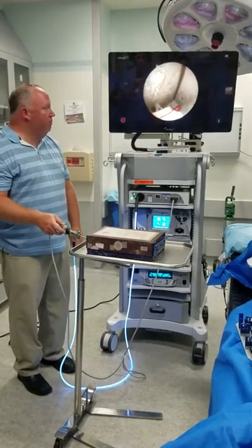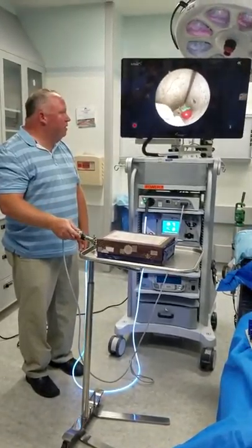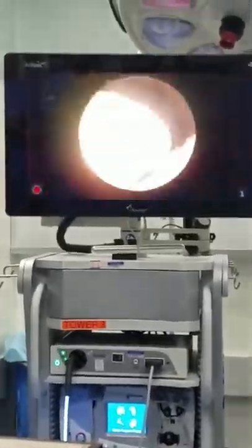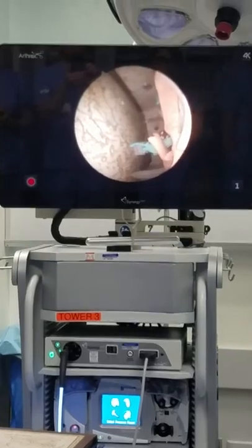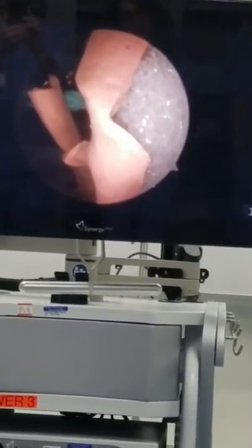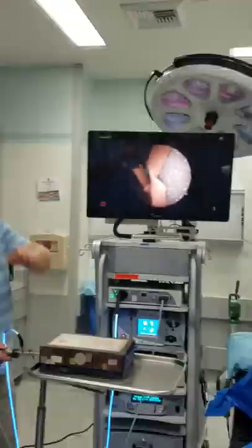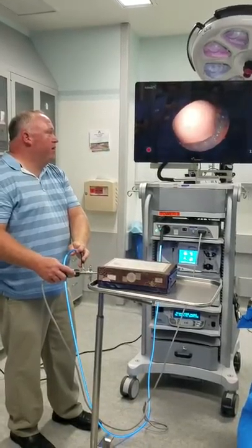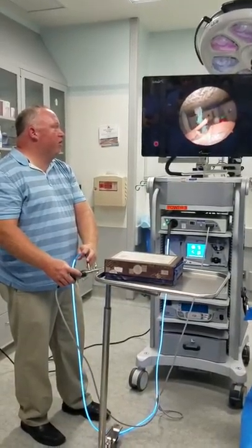So I know what's in here, so I know what I'm looking for, I know I can find things. Okay? There's an apple in here. Like a knee here. By turning the scope, I can see different angles. What I'm looking for here. So I look up. I look down. I'm changing the scope by moving where the scope angle is, where the face of the scope is, okay? It might get a little bit confusing, we might get a little bit sick, or whatever you call it here.